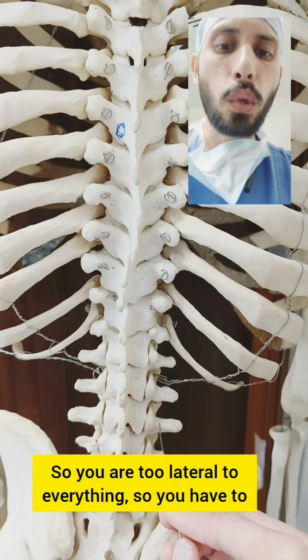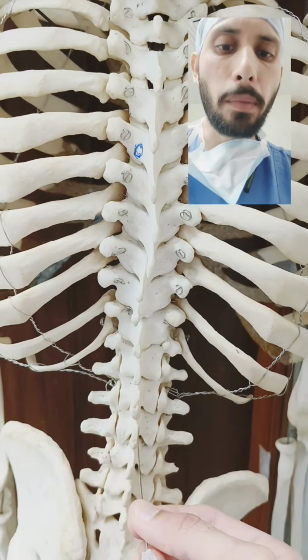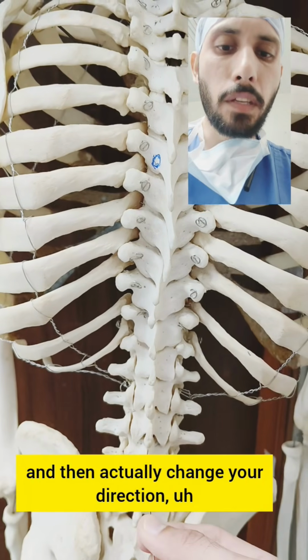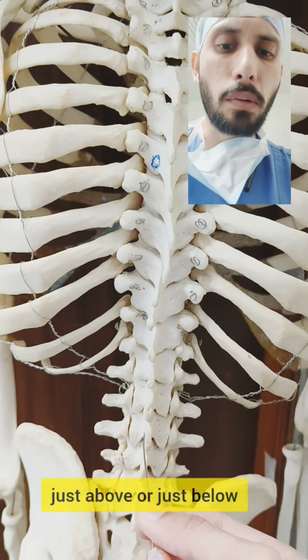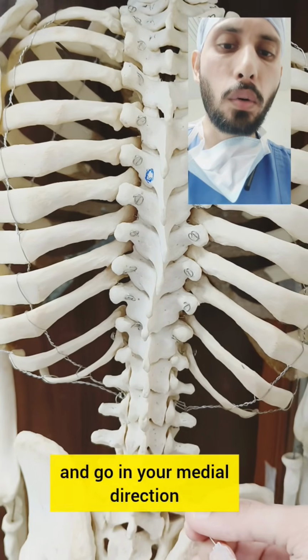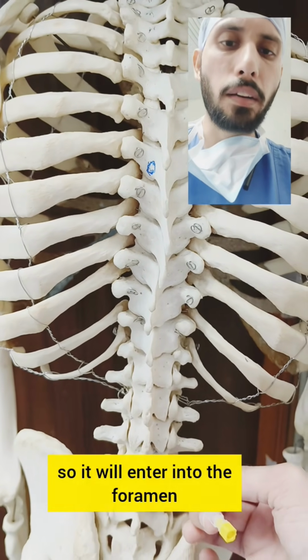So you are too lateral to everything. You have to go to the medial side, hit the spinous process, and then change your direction like this, just above or just below. Or you can follow a paramedian approach and go in your medial direction, so it will enter into the foramen.